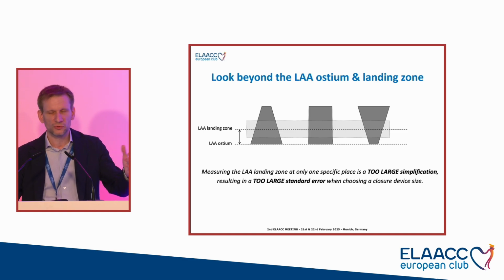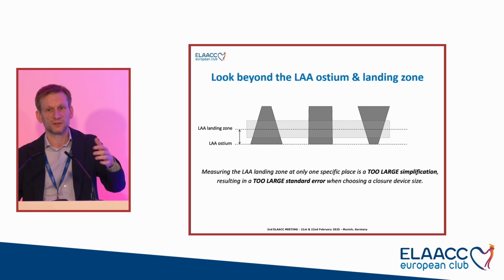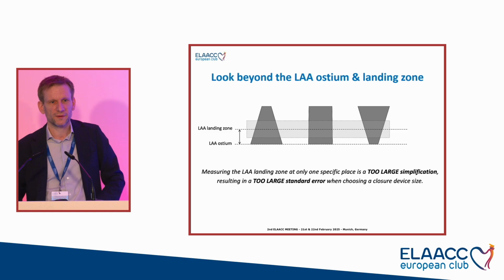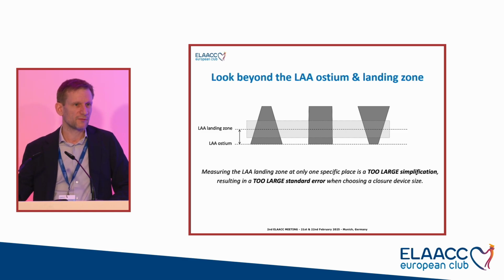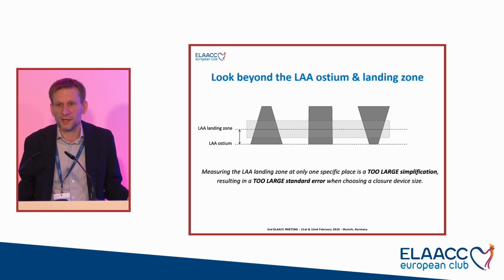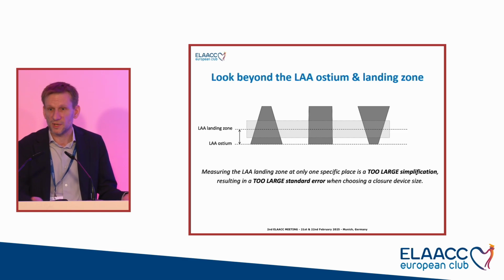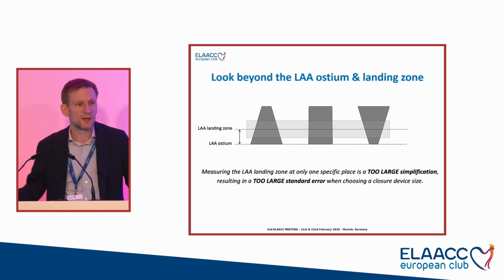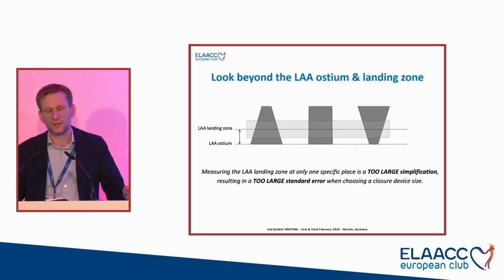Whether you do it with TE or with CT, I think it's too far a simplification to go just for a measurement of an ostium. And I see many operators doing this. Very often, in 90% of the real world, people planning a procedure show you some TE images from the day before where you think, what the heck? This doesn't serve anything, so that patient had a TE for nothing, to be honest. They show some images and say, yeah, you see there's an appendage, great, and you see there's no thrombus. But for the rest, it doesn't serve anything. So that's not good pre-procedural planning.